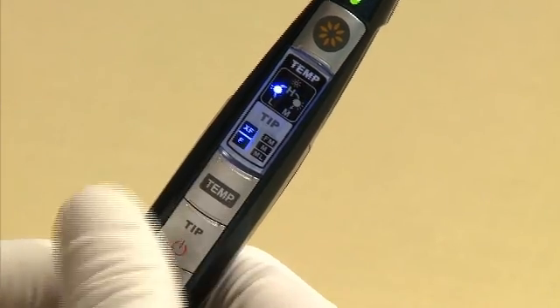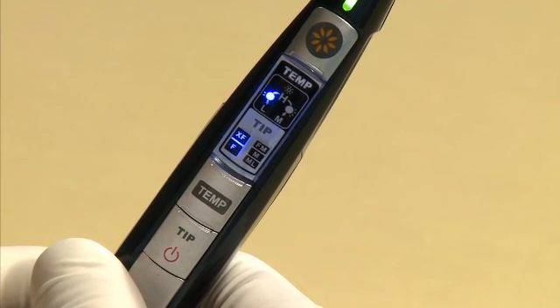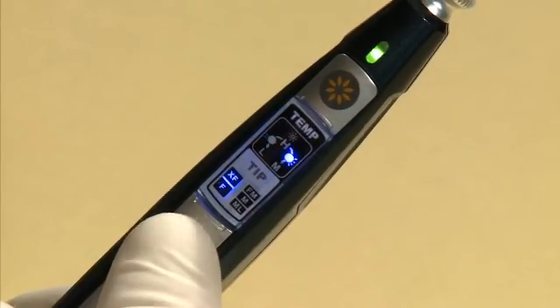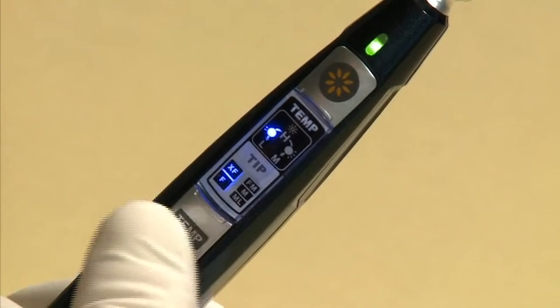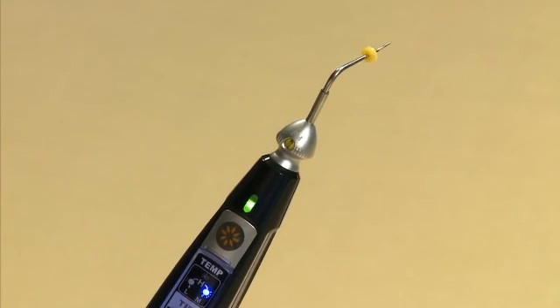Press once more and the temperature will change to the low setting — the indicator above L will light up. Press one more time and the setting will change back to medium. After setting the temperature, press the operation button.